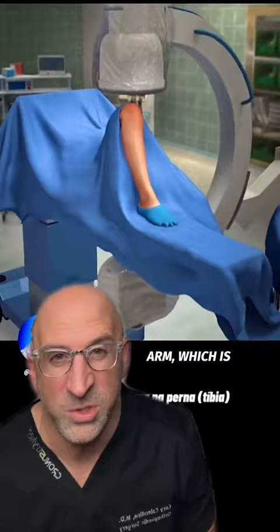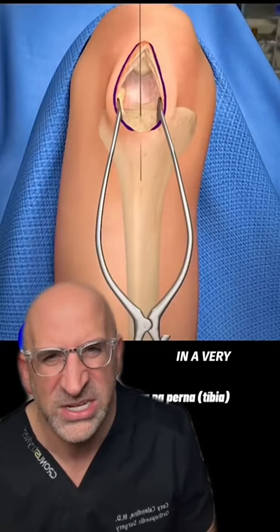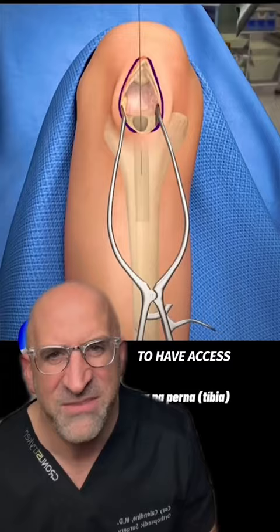I then open the knee to gain access to the top of the tibia. By using a guide rod, I can place it in a very specific location and then drill away the bone. This allows me to have access to the tibial canal, ream the inner aspect of the bone away so that I can place a metal rod.